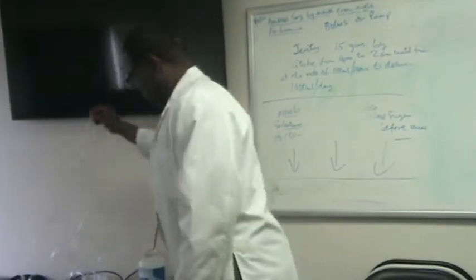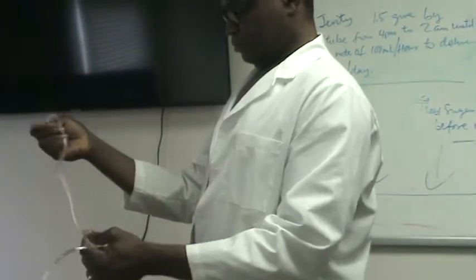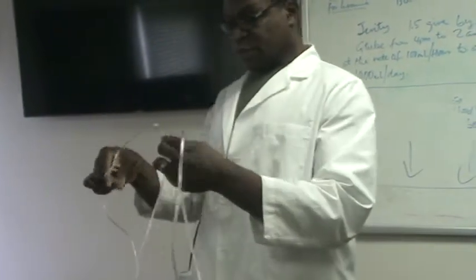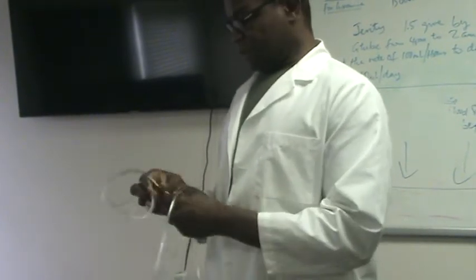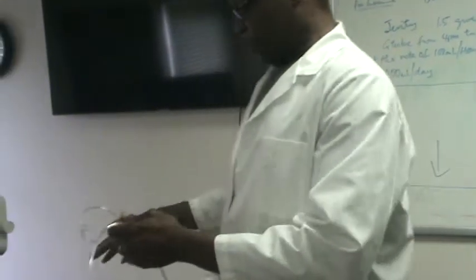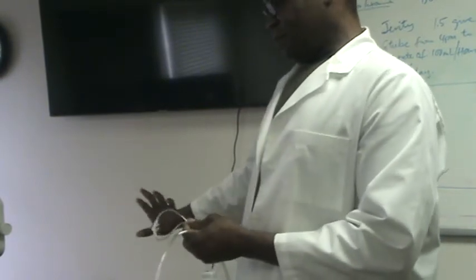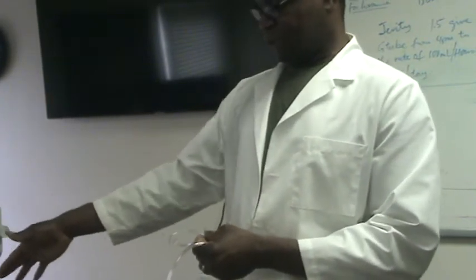Let me show you a breathing treatment. Oxygen, just for oxygen. You've seen an oxygen cylinder. Sometimes there's an oxygen concentrator, the bigger oxygen container that is stationary in the room. Or sometimes it could be a cylinder that is hanging behind their wheelchair. They can walk around with it.